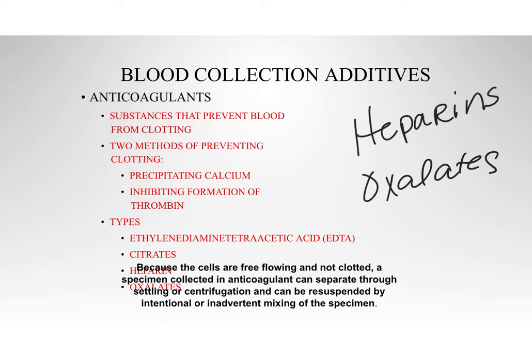Okay? Now, each of these is either going to bind the calcium or it's going to stop the thrombin, okay? You need to know some of these, and you need to know how they stop the blood from clotting inside that tube, okay?